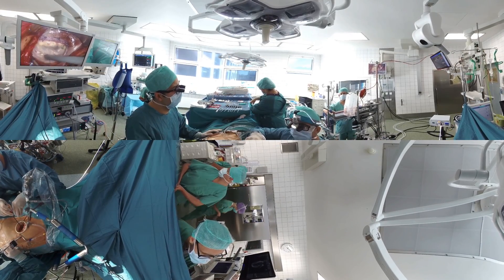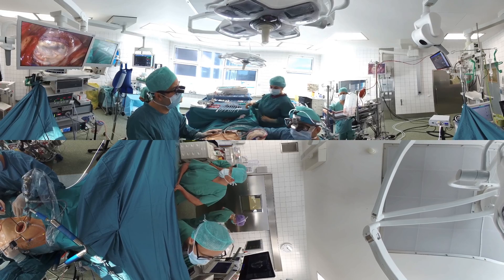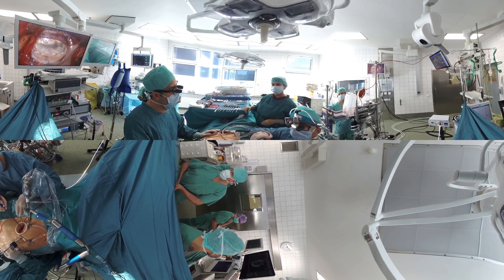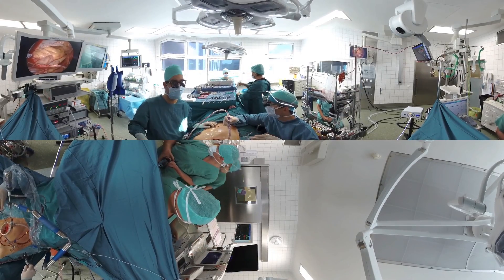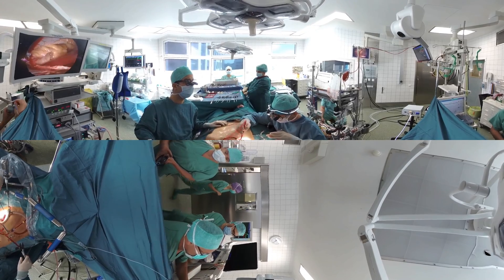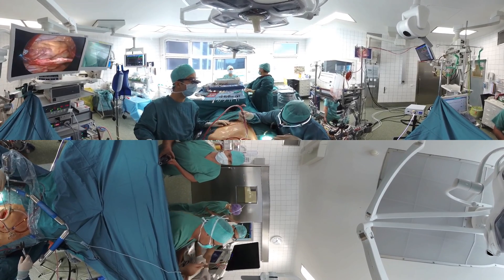The sutures are each cut at an appropriate length and a repeat water sealing test is performed. This shows that the mitral valve is now completely competent. The left atrium is closed and air is removed from the heart.